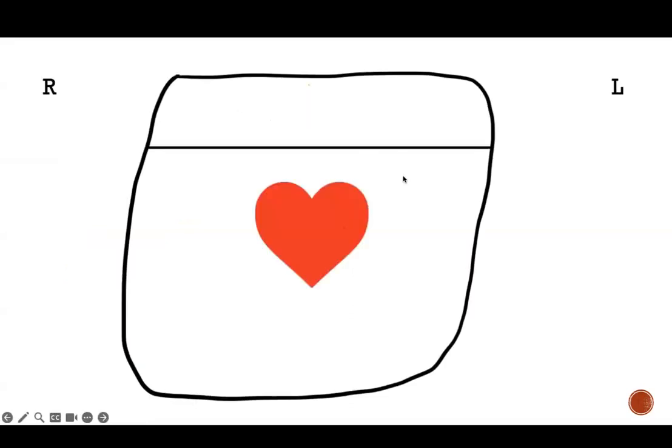So in order to simplify stuff, I'll be using my drawings. Excuse the drawing, but it will make things simple, inshallah. So this side is the right side. It's very important to orient ourselves around the side. So your left side is the right side over here. Just imagine this person is looking at you. So your left, if you're looking at a person, will be their right, okay? And the same over here, your right is their left.